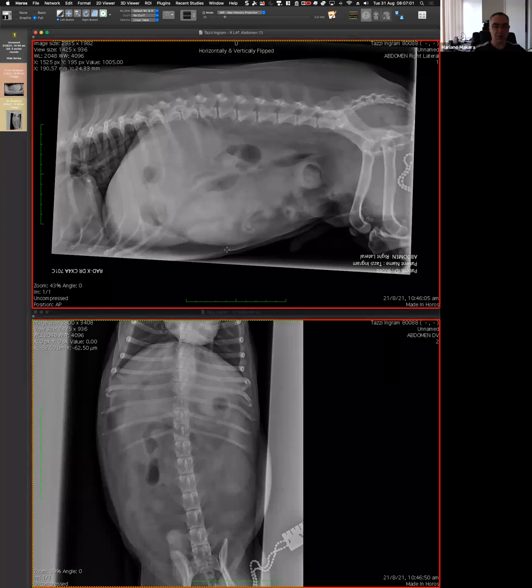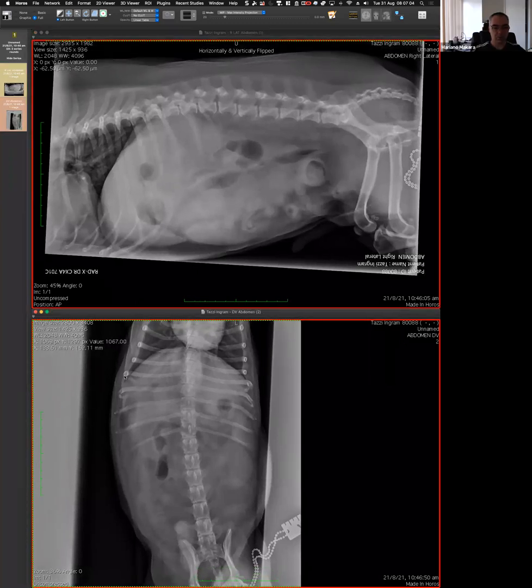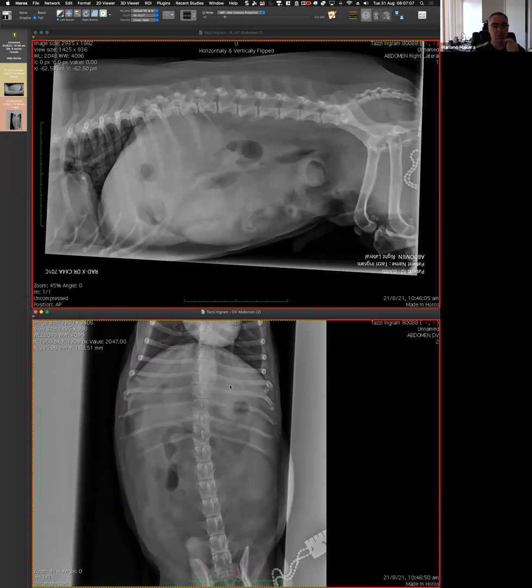So now the effort should be in trying to describe, and hopefully now with having discussed many cases, we're close to 100 cases, which in each of them we spent almost like an hour. Hopefully the description shouldn't be a frightening thing because it all comes down to, we locate something and then we talk about morphology, which is something is big, small, in the right place, in an abnormal place, or size, shape, contours, opacity, and location.